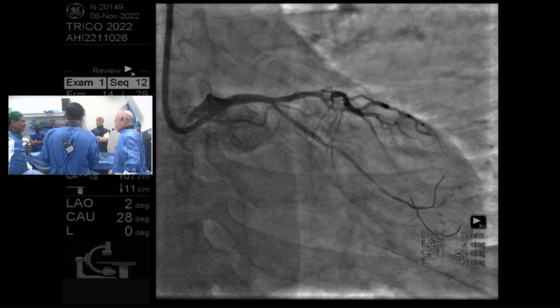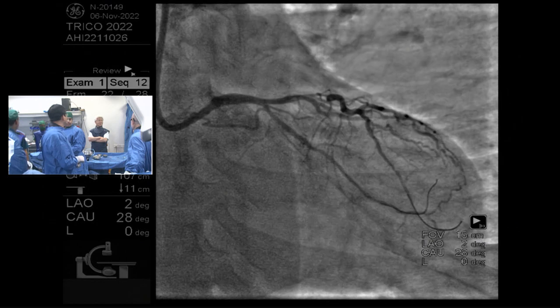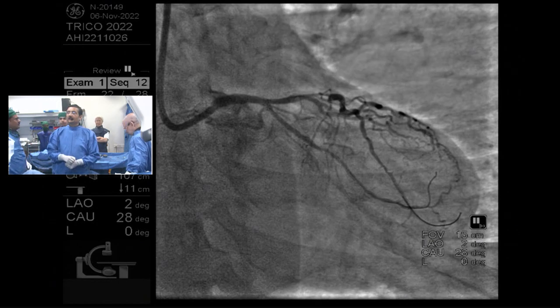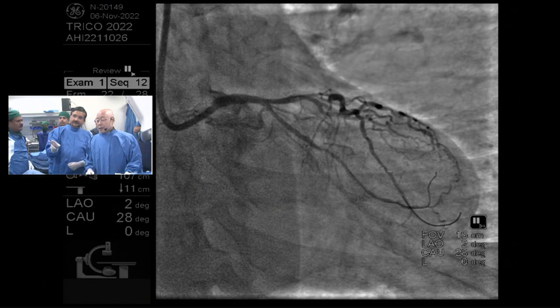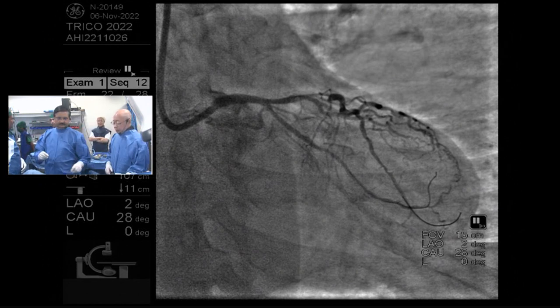So, 2 millimeter stent, yes. Please. They don't have DCB. Okay, no, but let's have that discussion anyway. So 2 by how much? I hear Dr. Sandra asking for a DCB, and it could be a very viable way to do it.